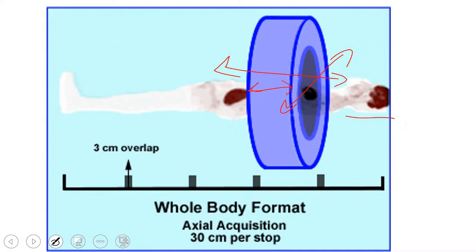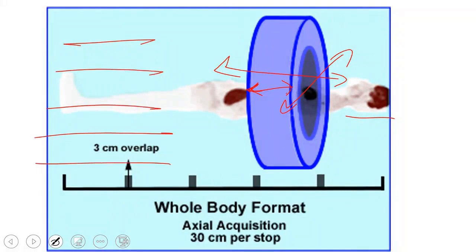You take this width, which is referred to as the area you are imaging. You take images of a specific area, and then the device moves to the next area. So you have it divided into blocks like this. You take images, then move to the next block, and then move to the next one, continuing this way. It depends on how many rings you have here.